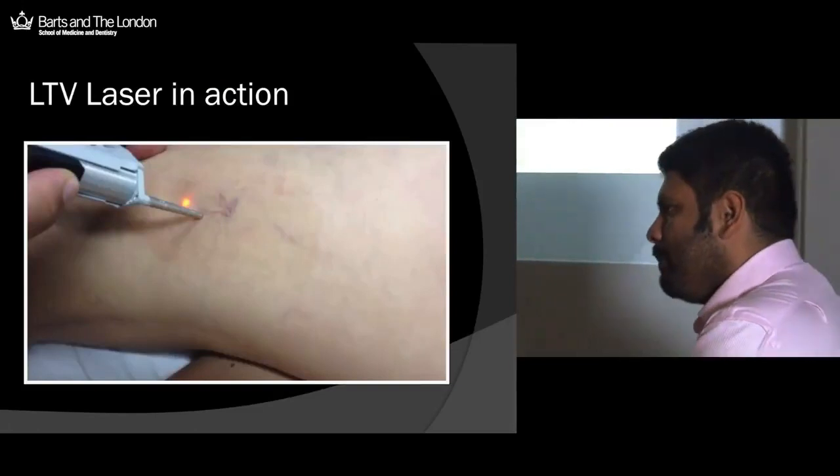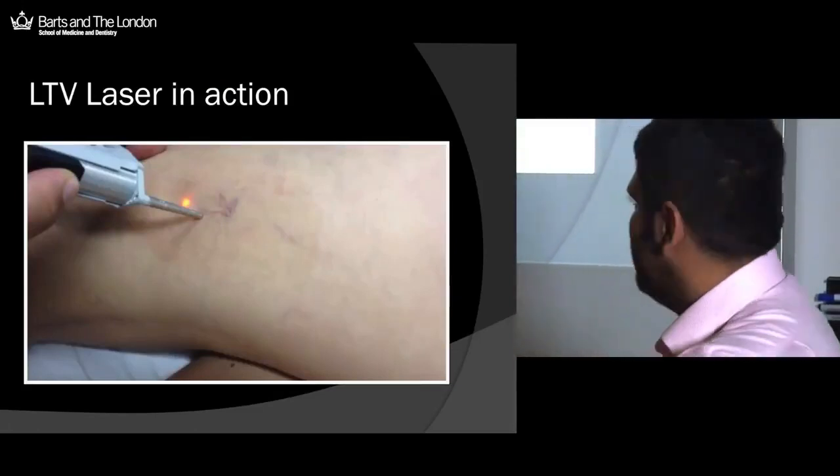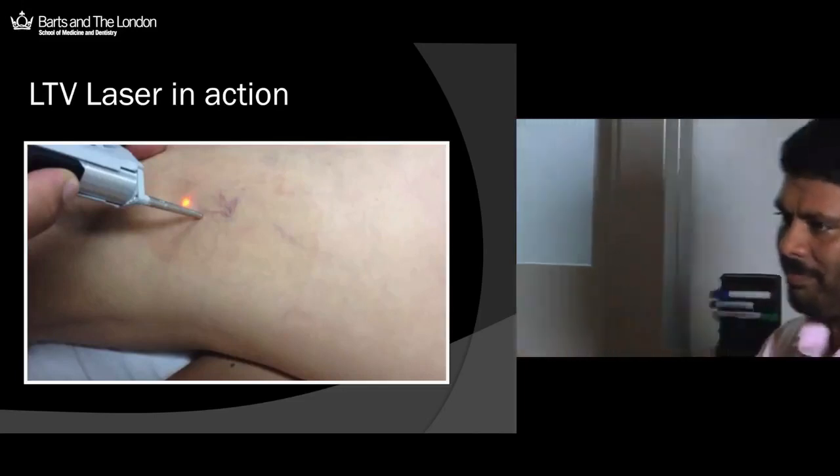So, you know, always seek to further your practice, add better ways of doing things, and clients like this because of its swiftness, the lack of bleeding, the lack of bruising, and the quick, immediate resolution that they get as well. So, you know, don't underestimate the power of laser in leg vein treatment. You'll often hear things said like, sclerotherapy is the gold standard. Sclerotherapy may be a gold standard, but combined treatment is even a platinum standard. So aim for platinum standards. Good. All done.